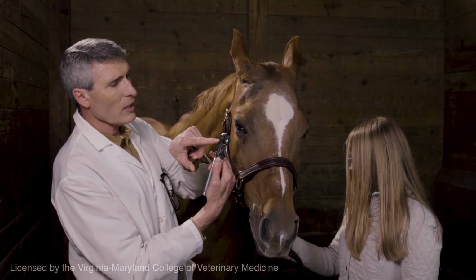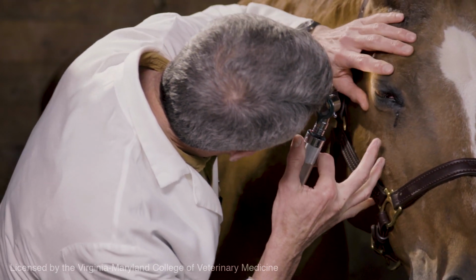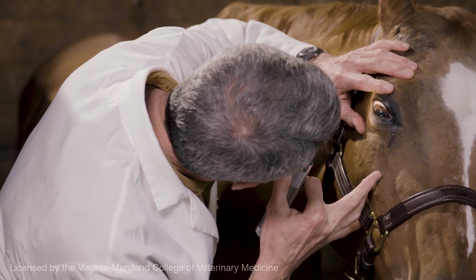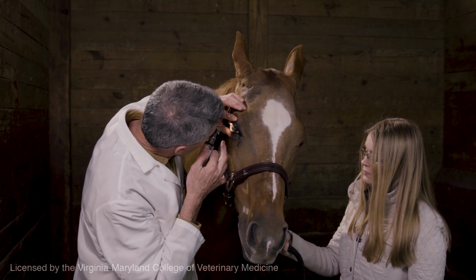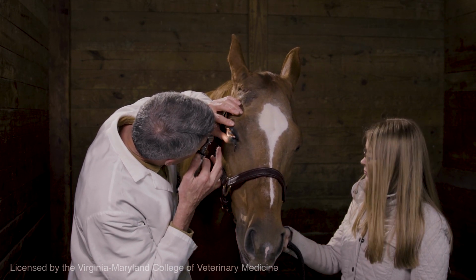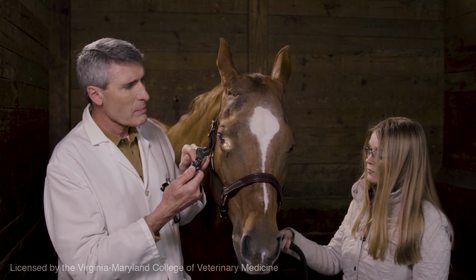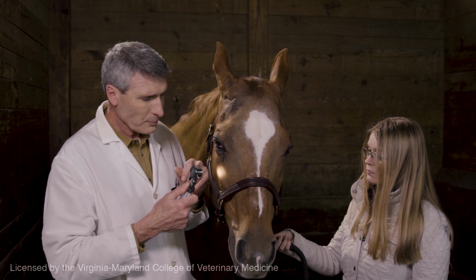But I'm going to have a lot larger lens to look through. And so I can look at the surface of the eye from 4 inches away, or I can move in and see the iris in focus at about 2 inches away. And I have a nice big large lens to look through. So many people like to use the otoscope.